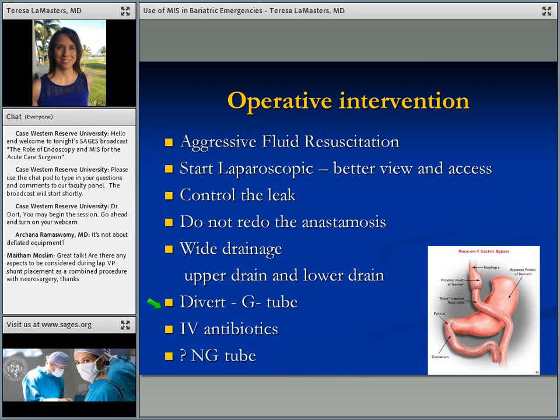When you get in there, it's going to be very confusing. Find the terminal ileum, just like you're going to do an appendectomy, and then you work your way back proximally. If you start at the ligament of Treitz, sometimes you make the pretzel tighter, and you don't know which way is which, and it doesn't make sense, especially if you don't do this routinely. So start distally, and it's going to unravel the twist as you're running the bowel.